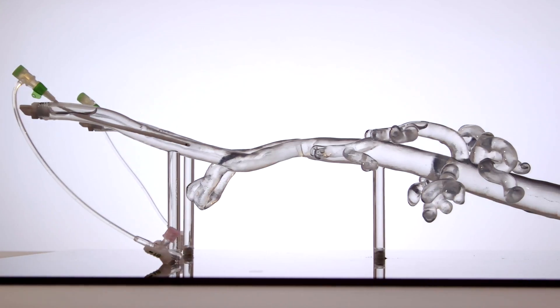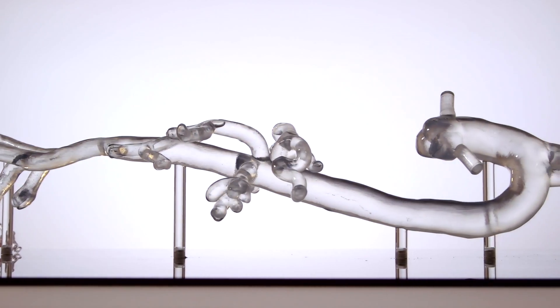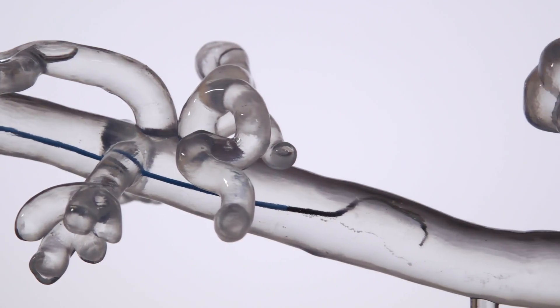This is Arteriosim, a unique endovascular simulator. It's a life-size recreation of the aorta and its major branches, created using 3D printing and data from a CT scan. Arteriosim is designed for early-stage endovascular training, to practice the catheter and guidewire skills that are essential for safe endovascular practice.